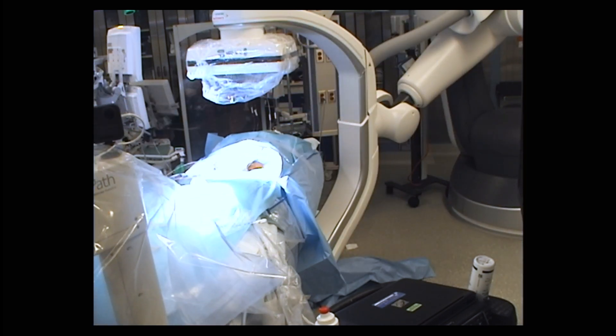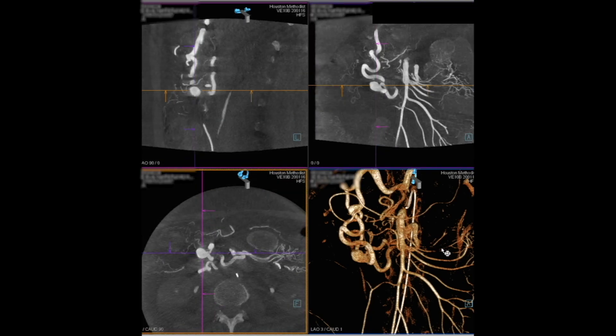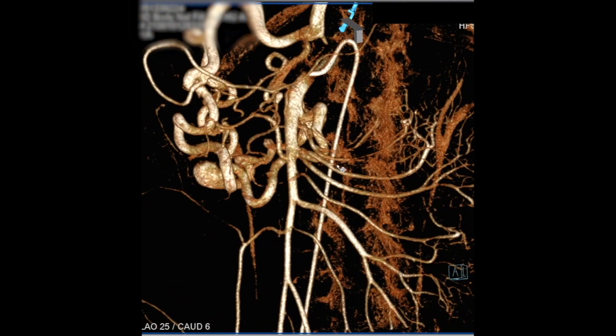We wanted to get better delineation of the inflow and outflow vessels, so we opted to do a cone beam CT, and you'll see the exquisite pictures that we can actually get from this. These are the kind of pictures you can derive by injecting directly into the superior mesenteric artery.